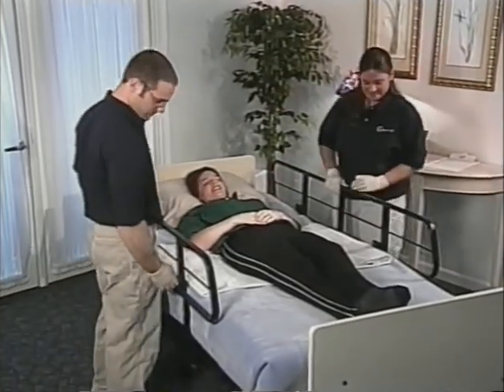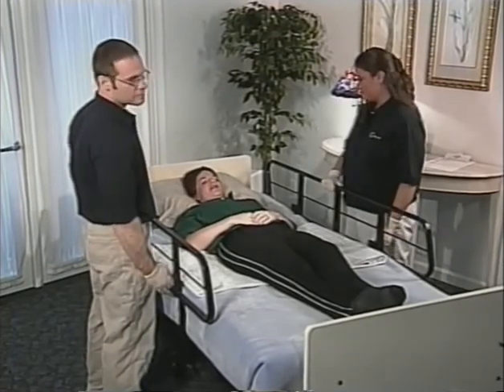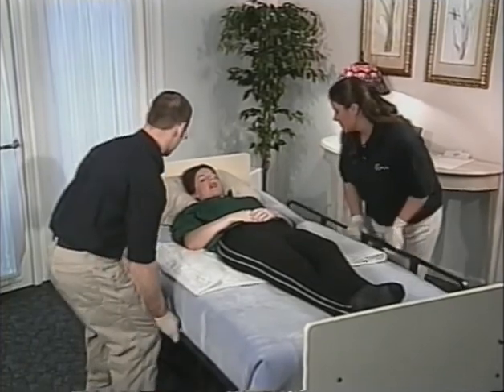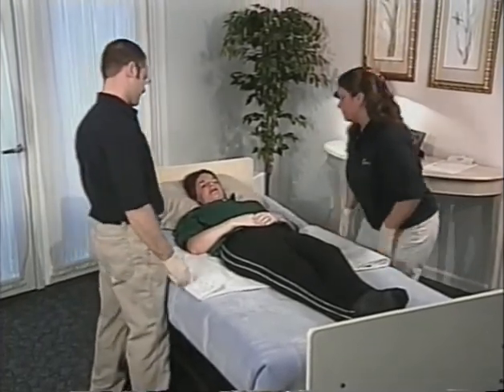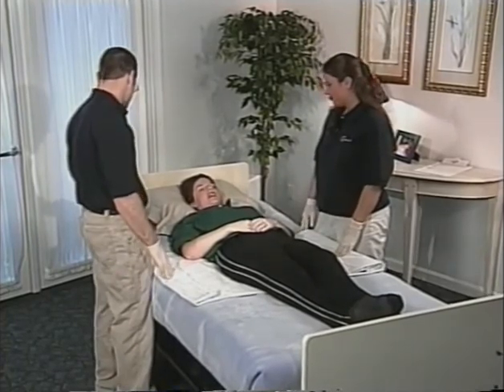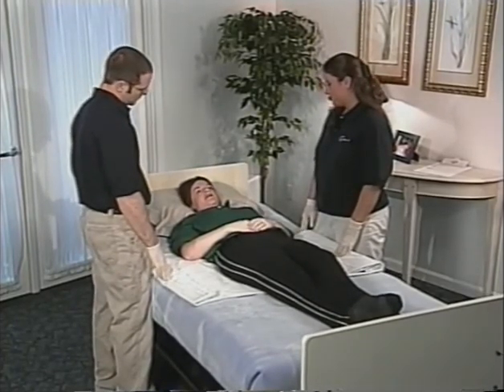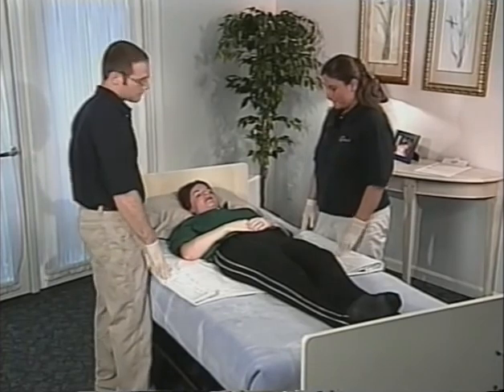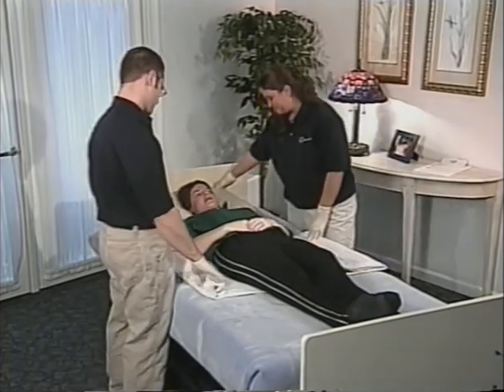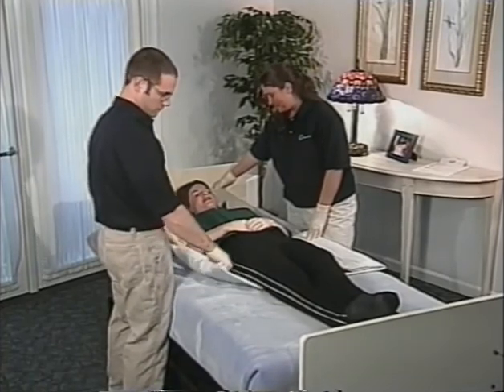Morning, Gina. Pull the bed out from the wall if necessary and bring the bed rail down. Position the height of the bed to your hip level and flat. Turn off any feeding equipment. Follow the following steps to position the client into side lying.